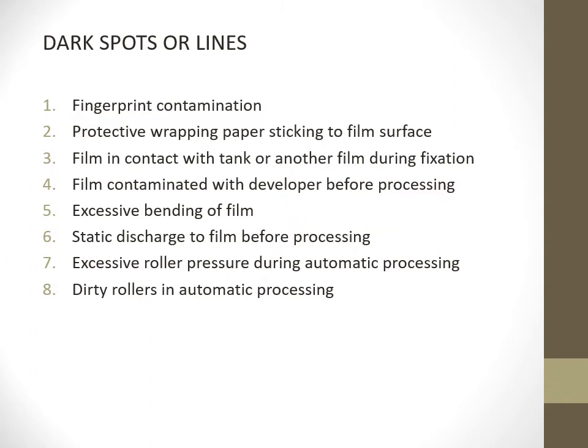Third, film in contact with tank. When you put the film into the developing solution, if it comes in contact with the tank or another film during fixation, or if the film is contaminated with developer before processing. See, only after you shoot the film it has to be put into the developer. Even before that, if it comes into contact with the developer, we might have dark spots or lines.